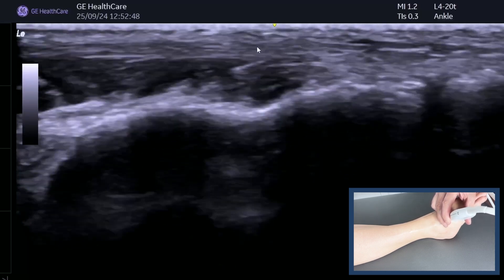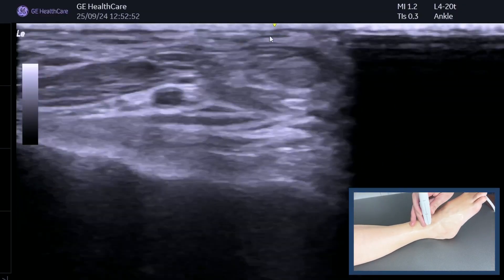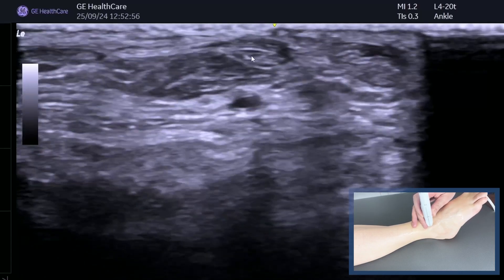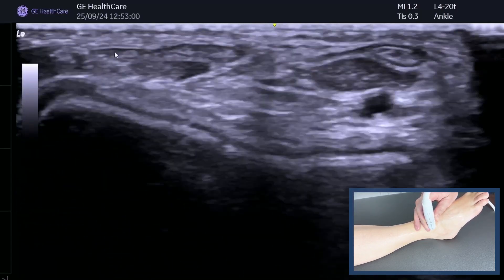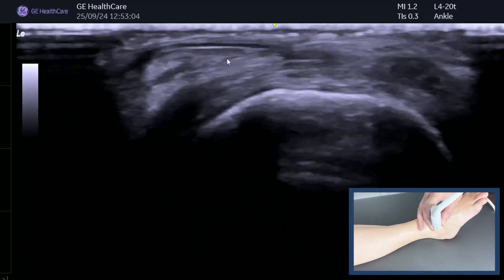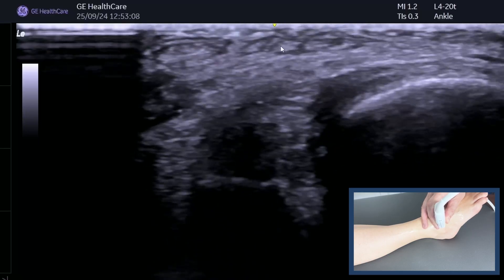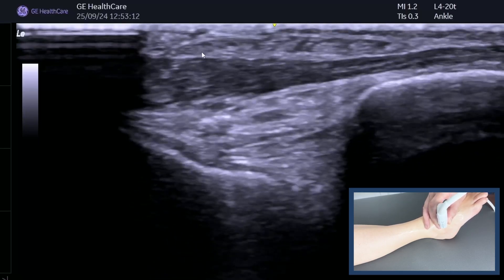To remember the tip: look at extensor digitorum — there's tibialis anterior, there's EHL, wiggle your big toe, come over to extensor digitorum, and in this case you can already see peroneus tertius. Confirm it by coming more distally: one, two, three, four — hang on, we've got five — and that's peroneus tertius.